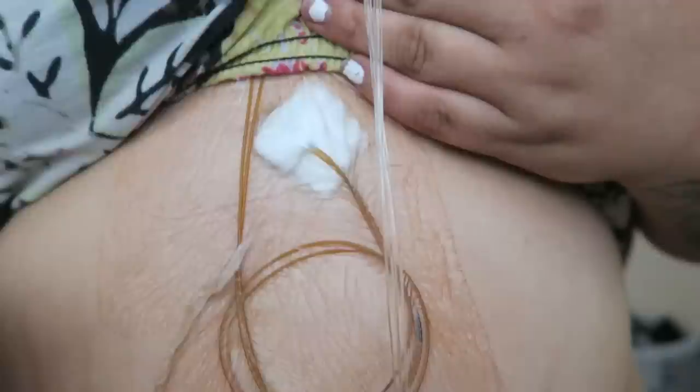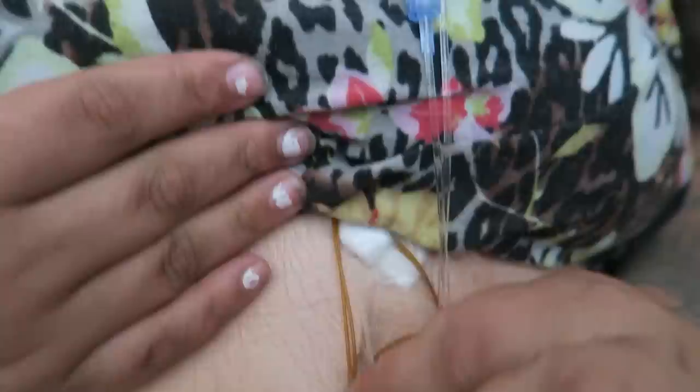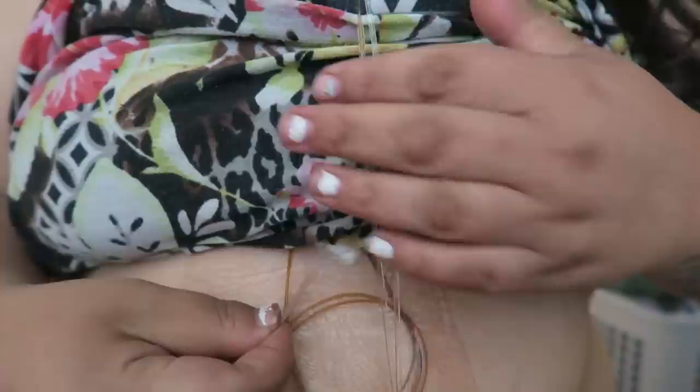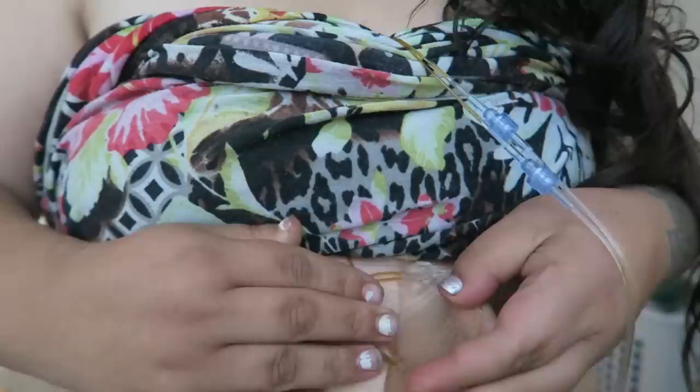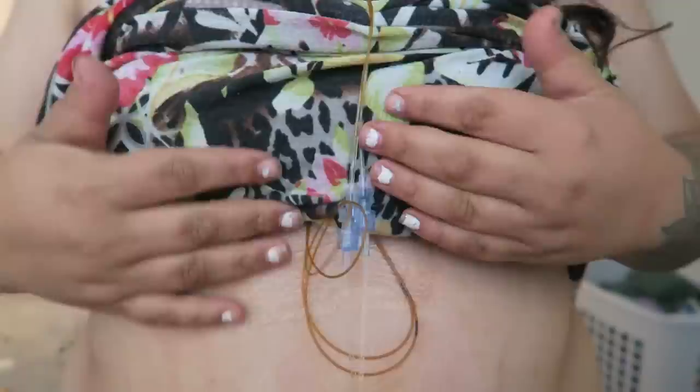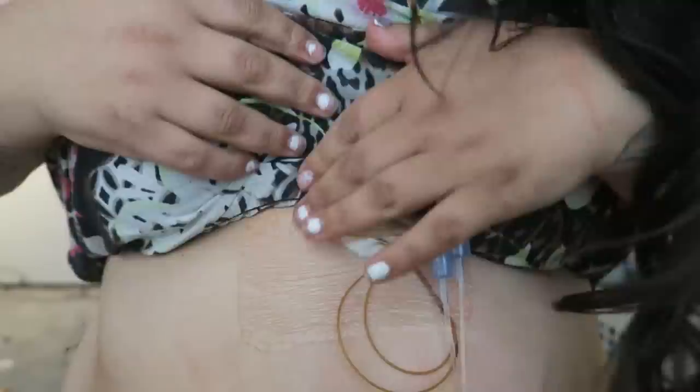Okay, so they're both running up through here. They have it in a circle I guess, and it has this little taping which is already coming off. I'm scared honestly, because I'm scared it'll hurt once I pull it out, but I guess we'll see. The tape is really thin — it doesn't hurt to come off or anything. First one is out! It's really thin, and that's gone. Now on to the most important one, which is this one.